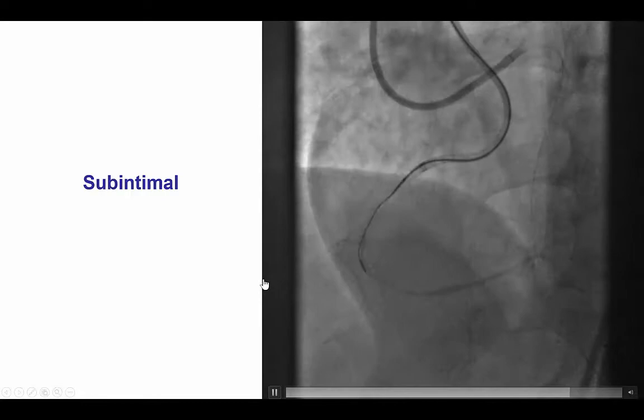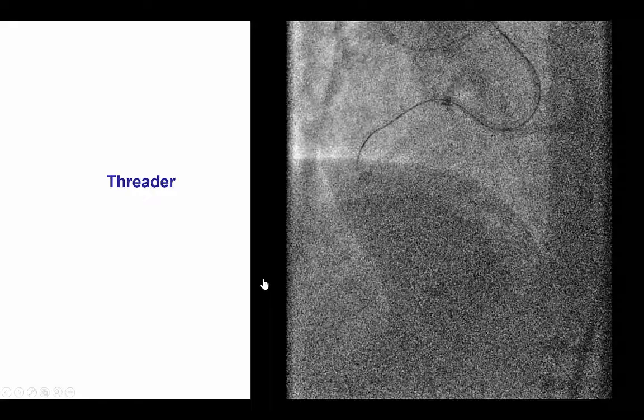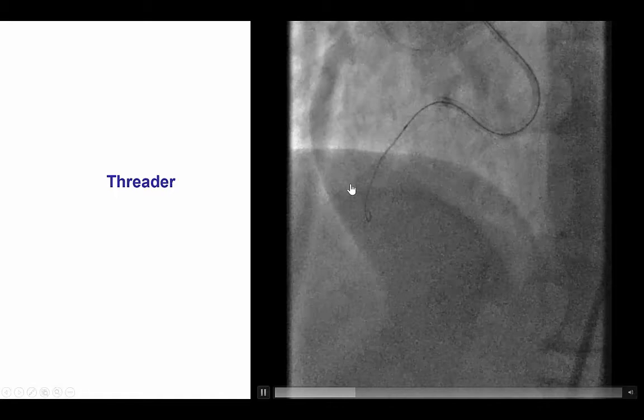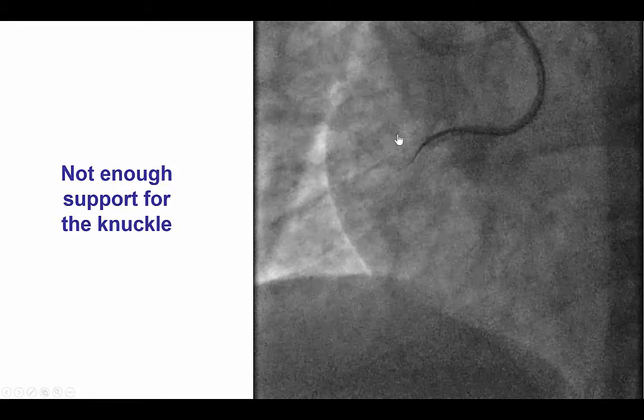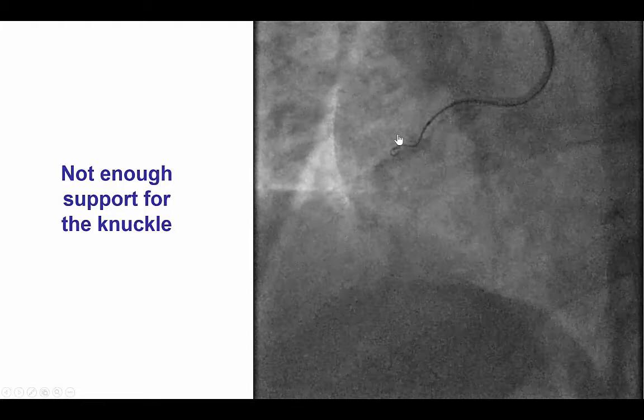Finally, the wire was in the sub-intimal space, which was encouraging. However, we then had significant difficulty advancing anything over this sub-intimal guide wire. The proximal occlusion was essentially a balloon-uncrossable occlusion. We did several attempts with a Threader and small-caliber balloons, but we were unable to cross and in the process we actually lost our wire position.